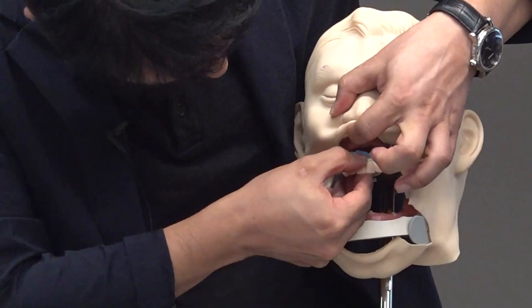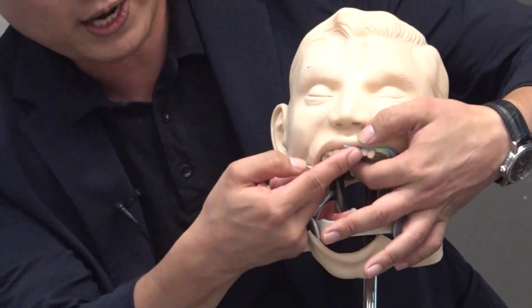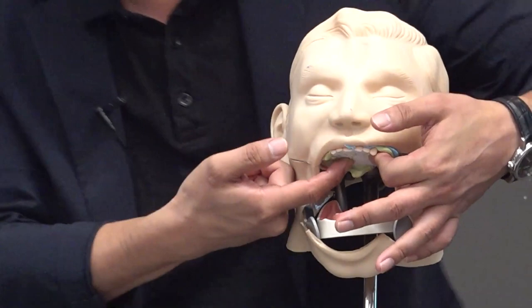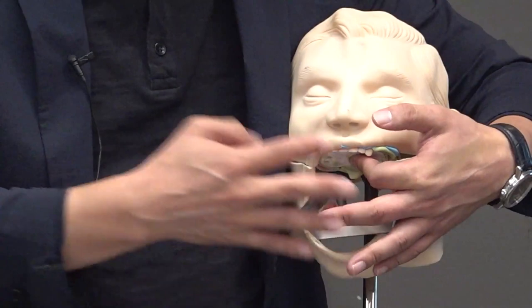upper plate. And then I check the lip support. If there is less lip support, I move it forward. Anyway, I have to adjust. And that's it. And then the patient decides on the appearance of the anterior teeth. That's finished. That's all.